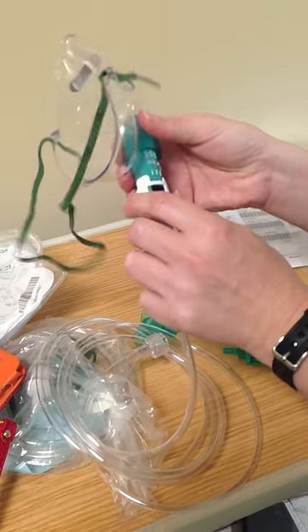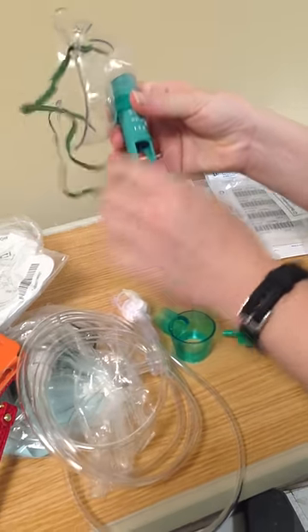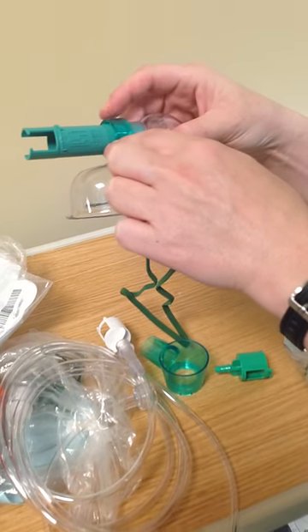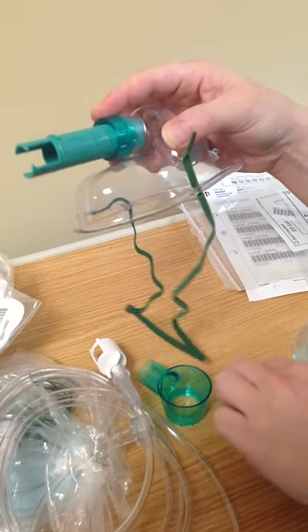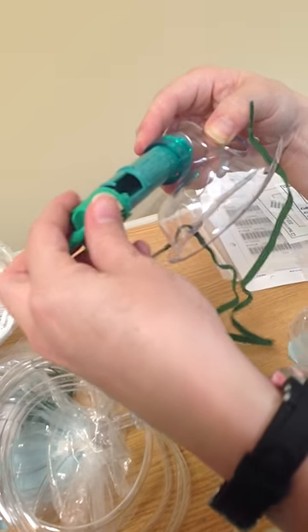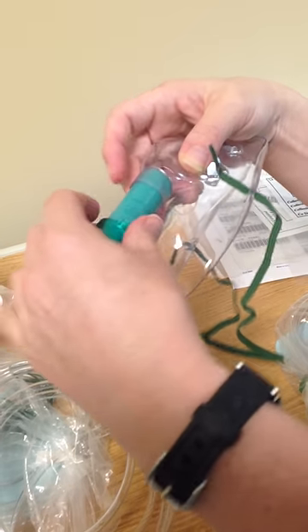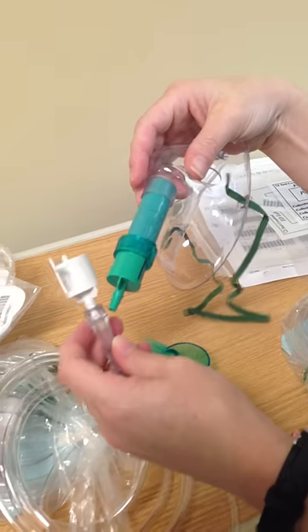And then if you need lower than that, the green on the other side is the lower percentage. 24%, 26%, which is the highest, is 6 liters. So if you wanted 30%, the green also has the arrow. You put it at 30%, which is 6 liters, and you put your oxygen on it.